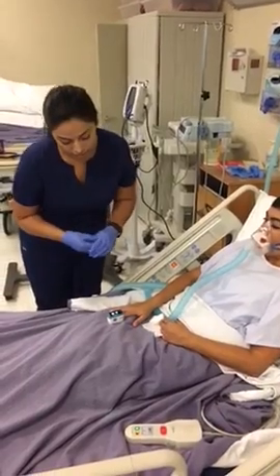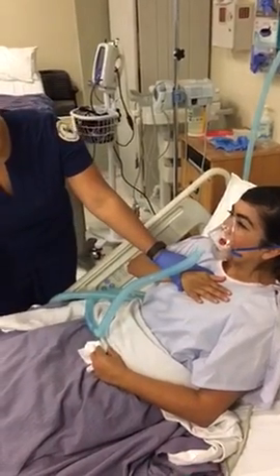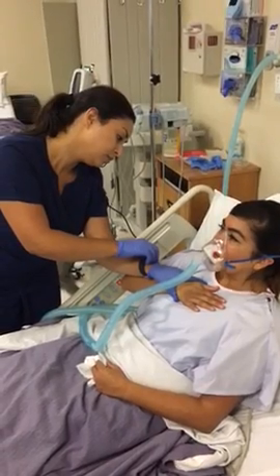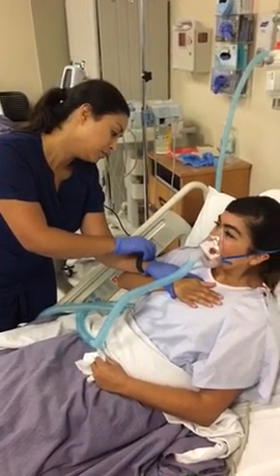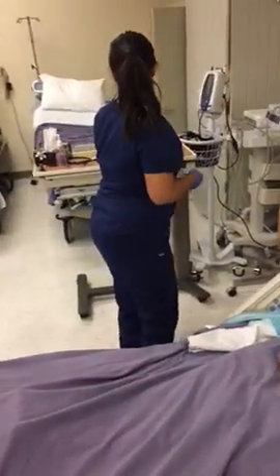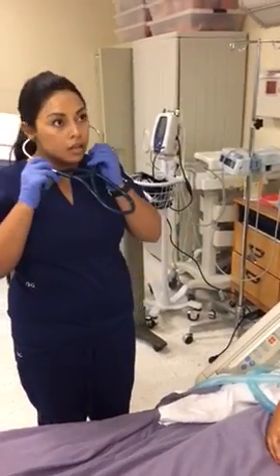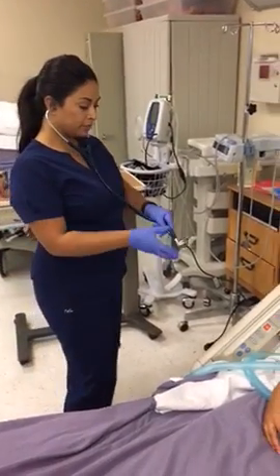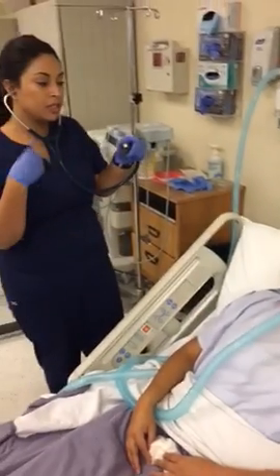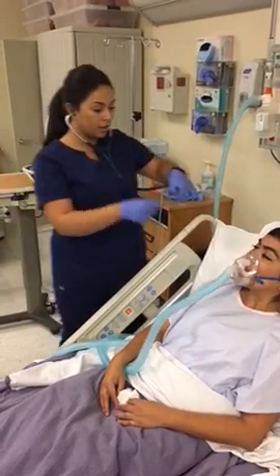Alright, I'm going to check your heart rate. You can go ahead and relax your hand. Next, I want to listen to her upper airway, make sure that there's no stridor or anything. Mrs. Islas, I'm just going to listen to the upper airway. I'm going to unzip your gown and I'll put it right back. Okay. Thank you.